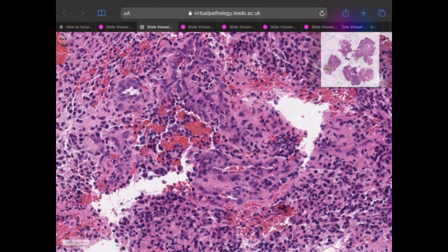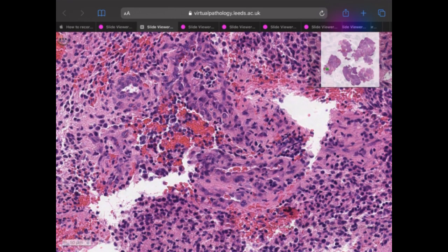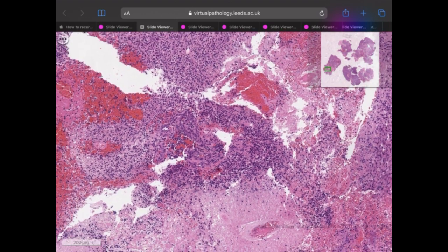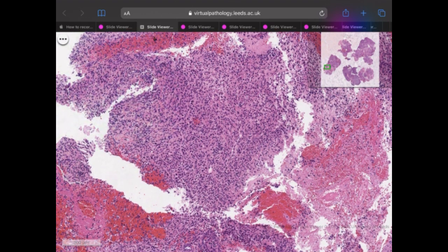And over here, I show you at the center is a microvascular endothelial proliferation. You can appreciate that there are spaces within this capillary-containing blood vessel, and the endothelium is more than one layer. So the presence of either necrosis or endothelial proliferation is needed to diagnose glioblastoma, or it can present both.